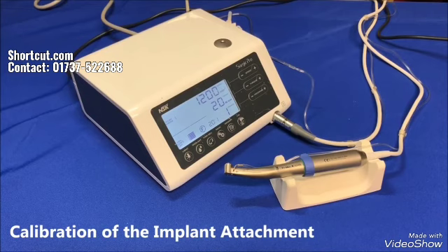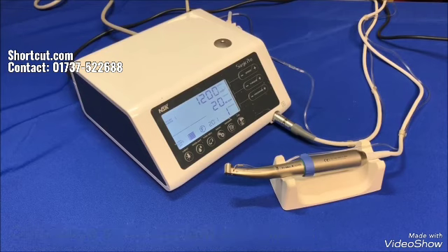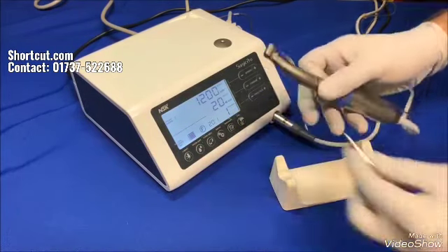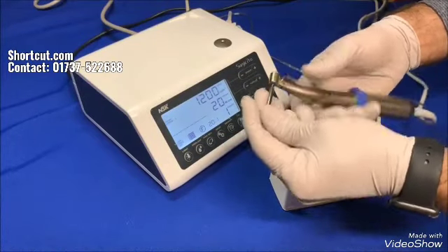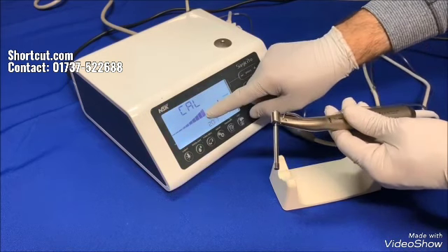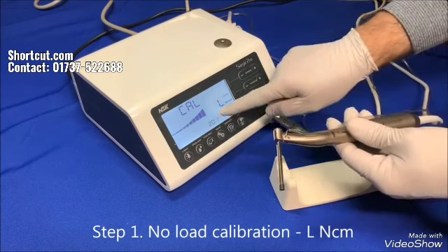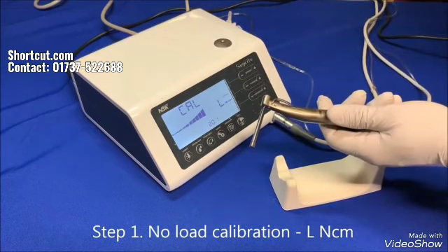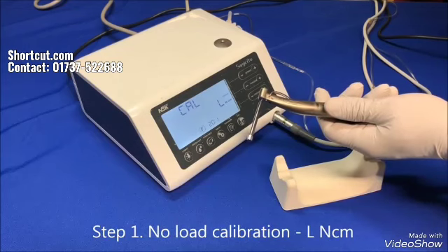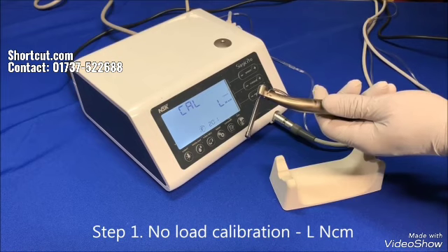Calibration is aligning the spec of a used or new attachment with the control unit to make sure the accurate amount of speed and torque is delivered through the attachment to the drill. As handpieces get old through normal wear and tear, or you want to use a new attachment with the motor, you'll need to perform calibration. Attach the 20 to 1 handpiece to the motor and insert the calibration drill into it. Press the calibration key for about two seconds — a long beep will be heard and the display will turn to calibration. For no-load calibration, the torque display shows L. Hold the motor in hand and press calibration. The drill will begin to rotate. Once this part is completed, there will be a beep sound and done will be displayed.